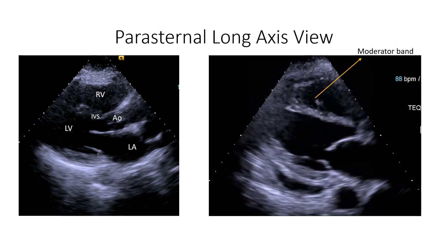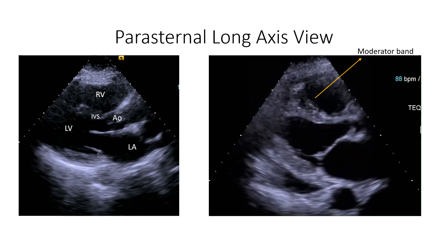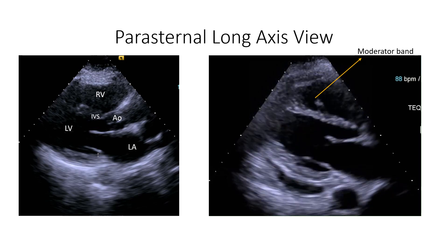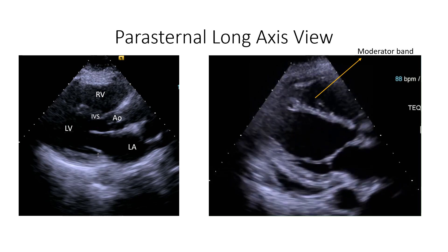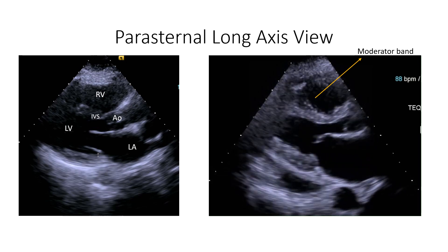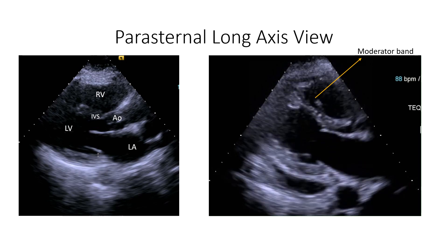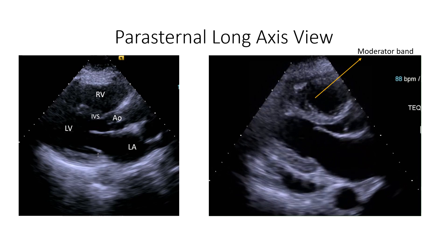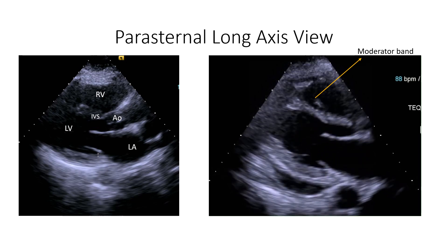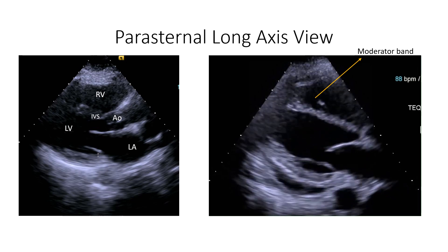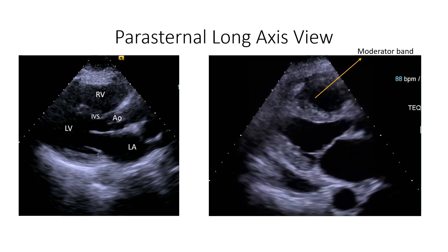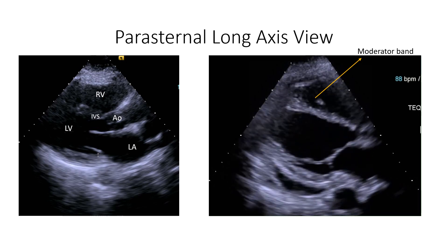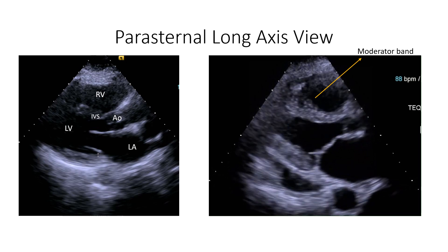This shows the parasternal long axis view. You can see the right ventricle, left ventricle, left atrium, the aorta, as well as the intraventricular septum. In this view, we can measure the right ventricular hypertrophy that occurs with chronic pressure loading. We can also view any intraventricular septal deviation or thickening. The moderator band is also seen on this echocardiographic view.